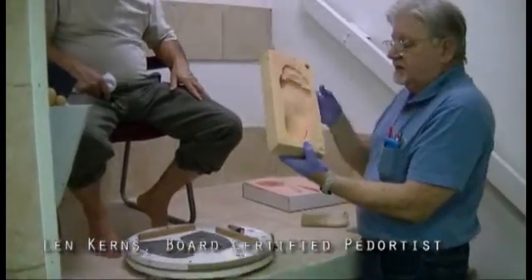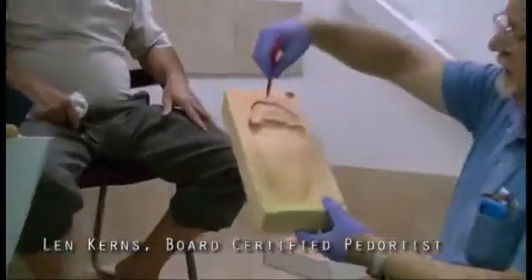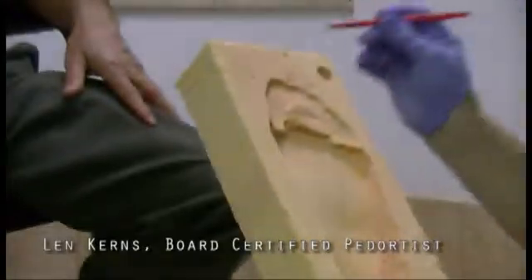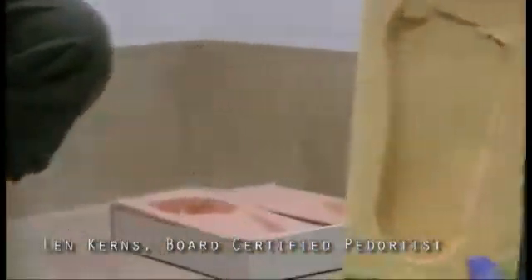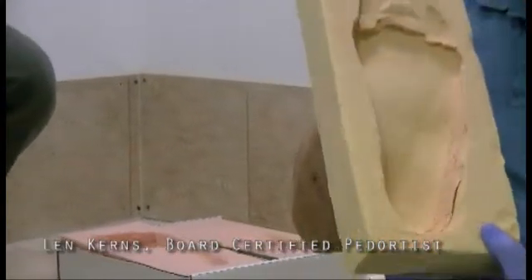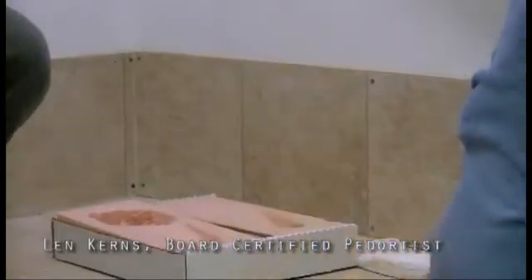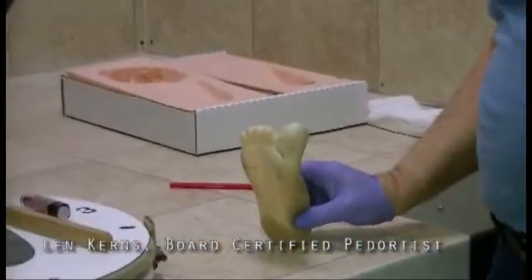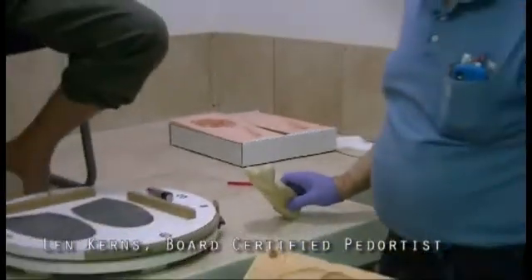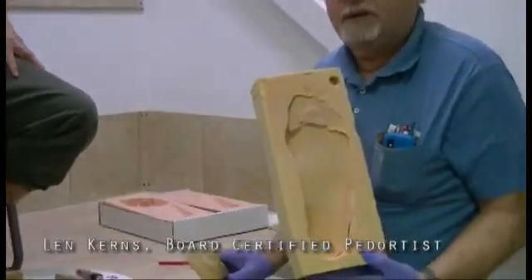And here's how some casts come in. As you can see, the heel is real deep and there's nothing up here. And this is what gets me. Educated doctors who went to school will send this in and think they took a good cast. And you don't have the patient walking around with their toes facing the ceiling. So I kept calling doctors and telling them to recast, which means they would send in two casts the same way. It means they never even looked at what they were doing.